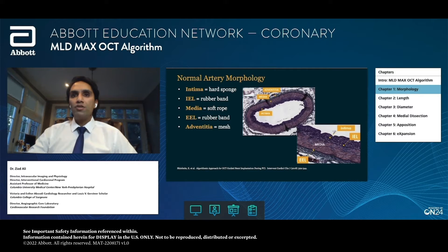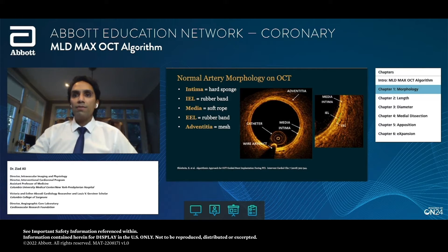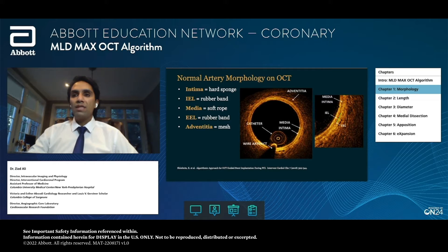Understanding the hard sponge, the rubber band, the soft rope, the rubber band, and the mesh will help us contextualize both the vascular biology related to interventional cardiology, but also image interpretation. If we go ahead and look at this normal OCT cross-section, we can see that we're able to see all of the layers that we can see on the autopsy with incredible detail.